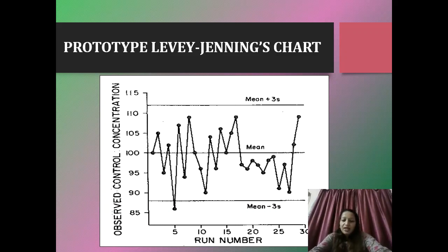In case it is not so, it is an outlier, there has been an error or a warning, and accordingly we may or may not need to take some sort of corrective action, which we will see in the coming slides.